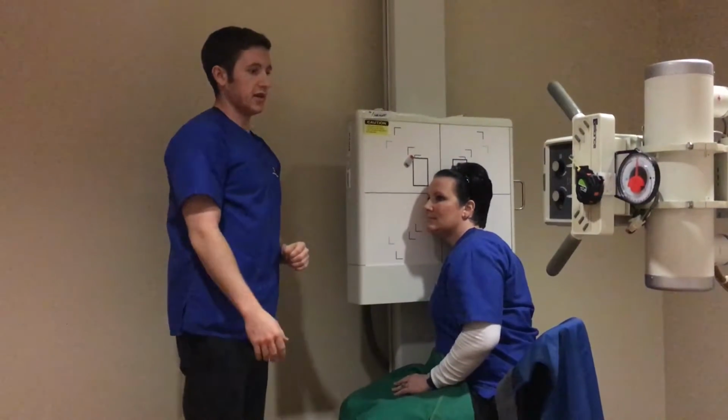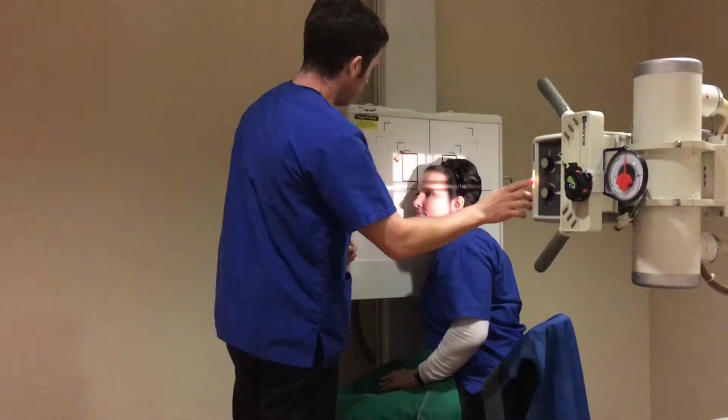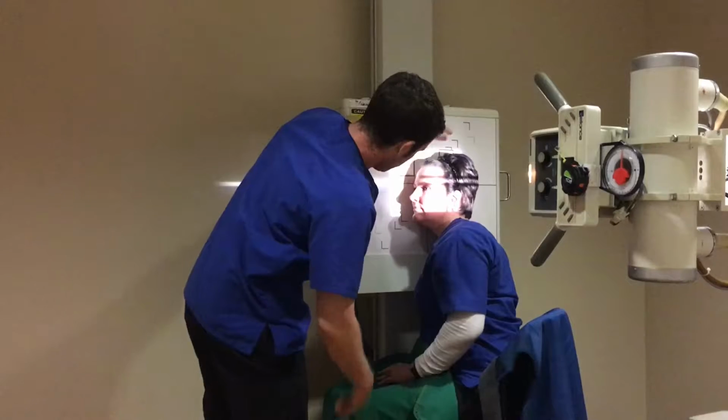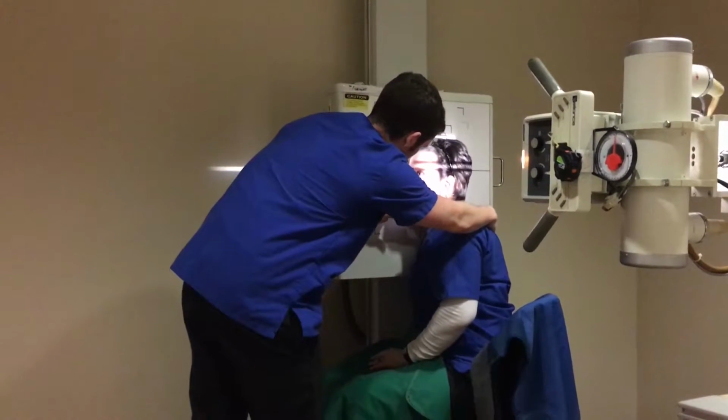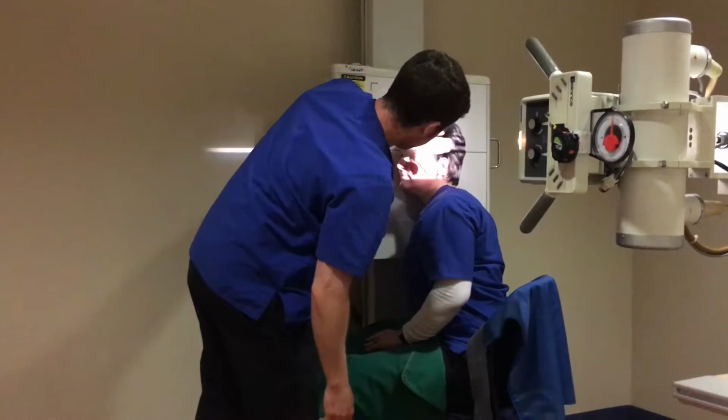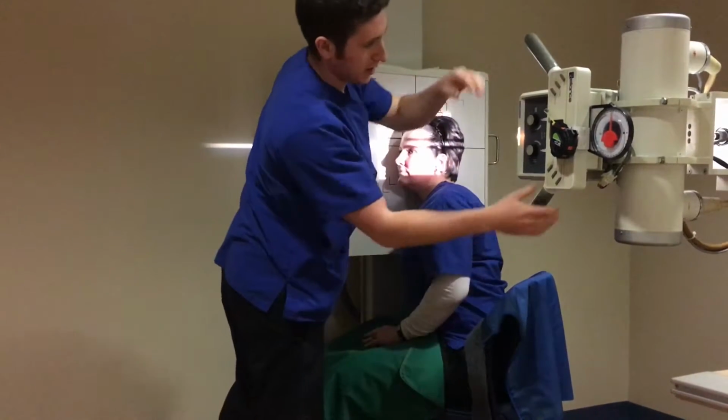Once I've done those things, I can align my part. I want to be approximately 2 inches above the EAM and at the level of the EAM, so I'm going to have her come forward a little bit. I'm about 2 inches above. I can maybe come down a little bit.